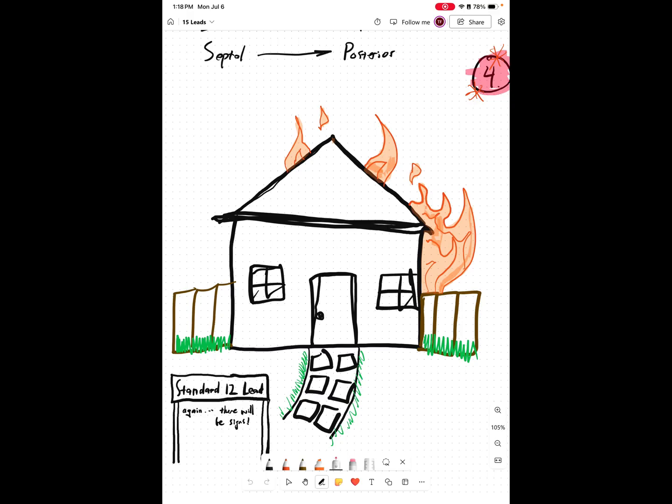This is not too unlike your normal 12 lead. Our 12 lead is going to give us a certain vantage point that is definitely relevant and important, but it is not comprehensive entirely. And so there will be signs that your patient is experiencing an event on the backside. And I need you to, again, be curious and pay attention to those signs that we just talked about. And if they're there, please consider the 15 lead and do it and see what it says.